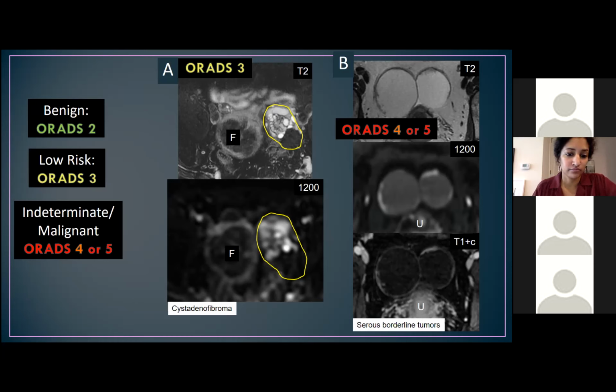And O-RADS 5, if you're going to diagnose something O-RADS 5, those people pretty much all go to gyn-onc. On the MR side, we actually did not come up with management guidelines because we decided that the positive predictive value for cancer is really what we're confident in.